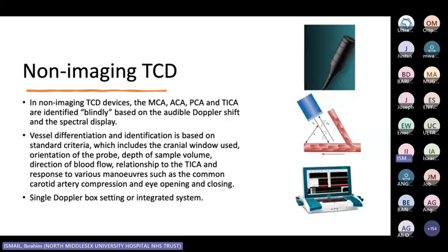mode of screening as well, rather than buying a whole ultrasound machine for this specific screening. And I think it's good for transport as well. You can easily place a Doppler box. I've provided outreach programs outside of London, and I've gone across England as well. I just had my Doppler box, which is very small, as the name suggests.